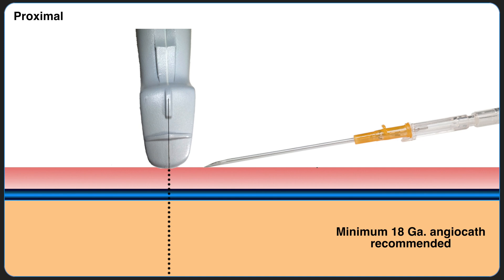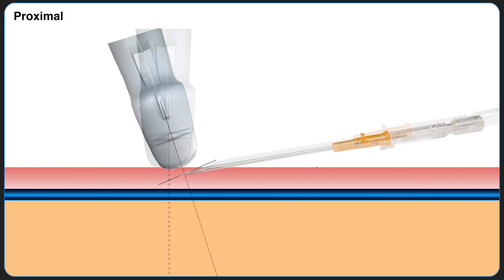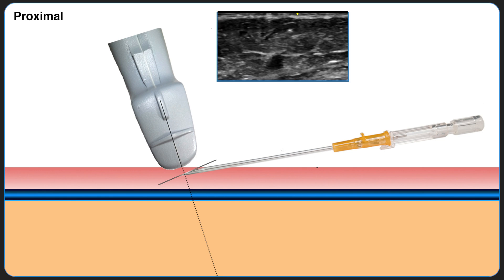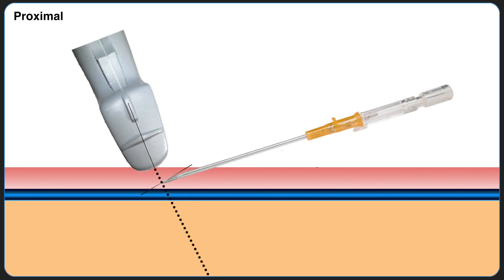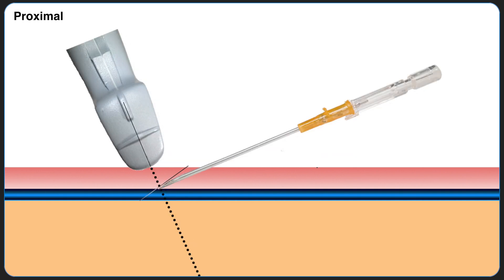There are two distinct phases in using the bevel to accurately locate the tip of the angiocath. The first stage of tracking the bevel is from skin to entry into the vessel. The emphasis here is on keeping the beam perpendicular to the plane of the bevel. To do so, the operator tilts the transducer to optimize conditions for visualization of the bevel. The tip of the bevel can be visualized as a hyperechoic dot in the subcutaneous tissue. As the needle is advanced, the ultrasound transducer is translated at a similar angle to continue visualization.